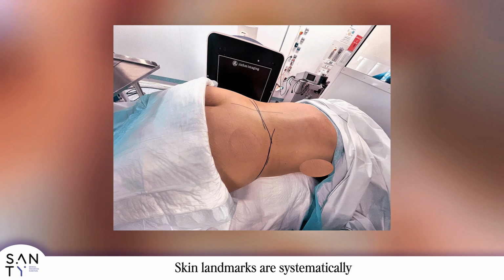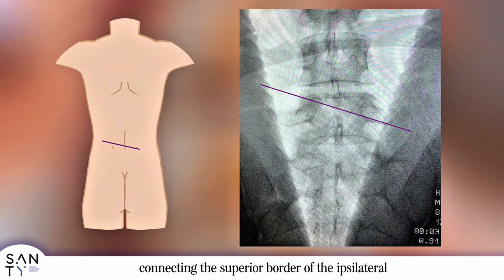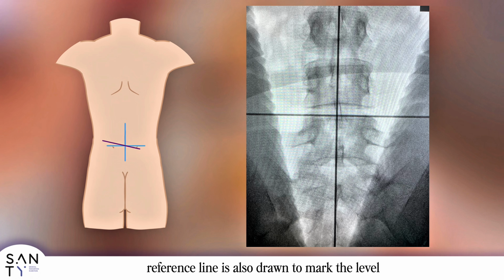Skin landmarks are systematically marked under fluoroscopic guidance before making the incision. We begin with an AP view. An oblique line is drawn connecting the superior border of the ipsilateral pedicle to the inferior border of the contralateral pedicle. A horizontal reference line is also drawn to mark the level of the targeted disc.